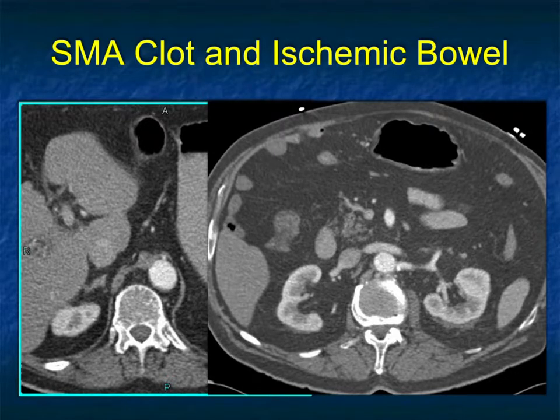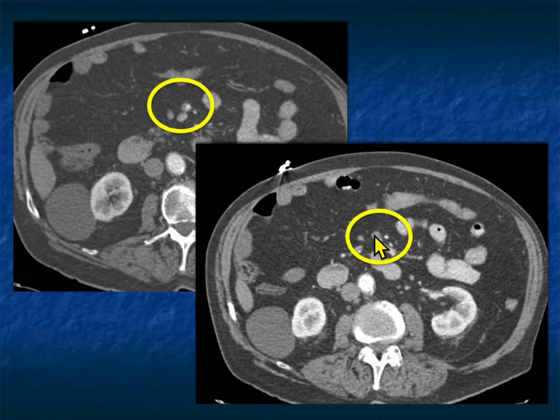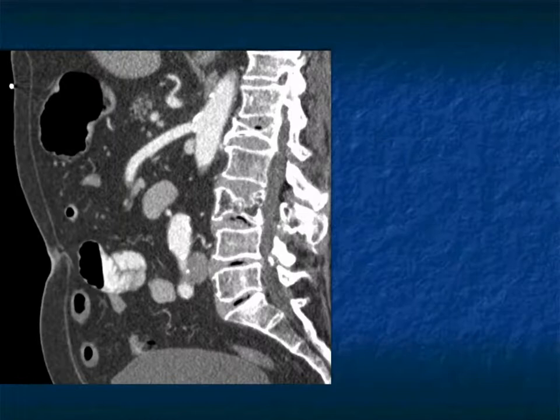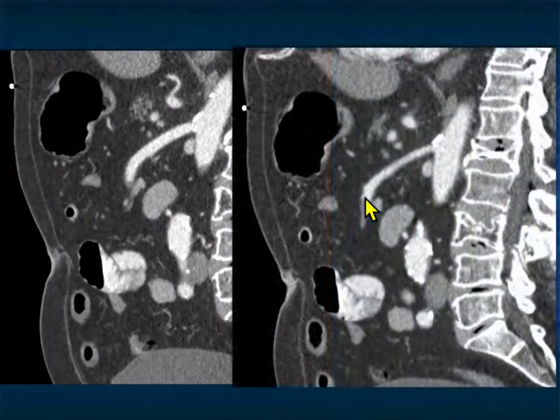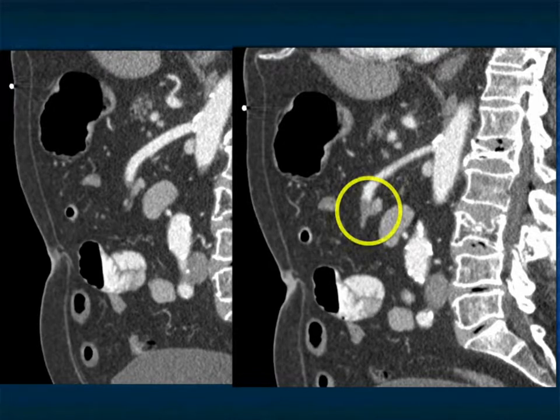Here's another example where the abdomen looks pretty good, the SMA looks pretty good, but when you follow it down, you could easily miss it — there's occlusion of the SMA but no inflammation nearby and no thickening of bowel. If you have the sagittal view, there's the SMA, there's the thrombus, very nicely shown. You have to look at the full length of the vessel or you're going to miss the occlusion.